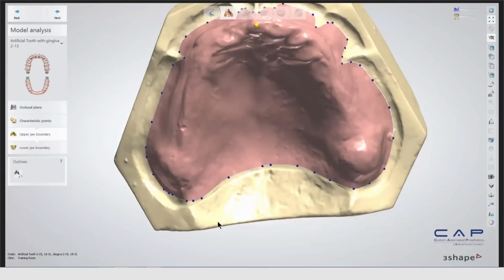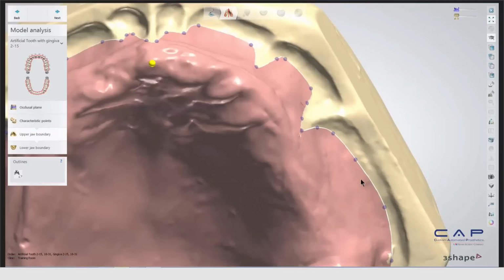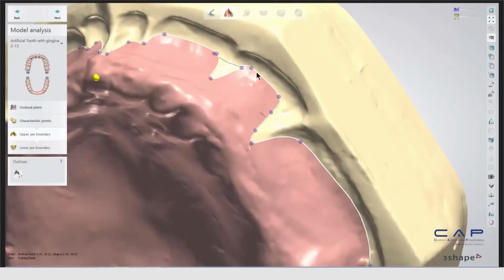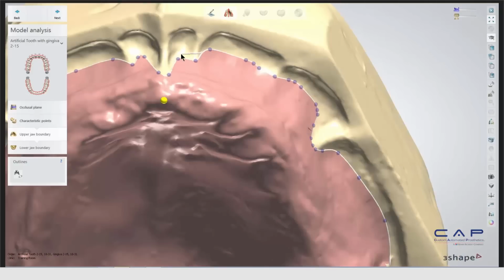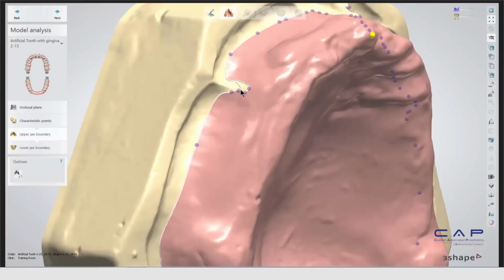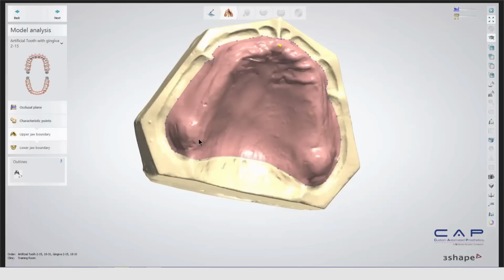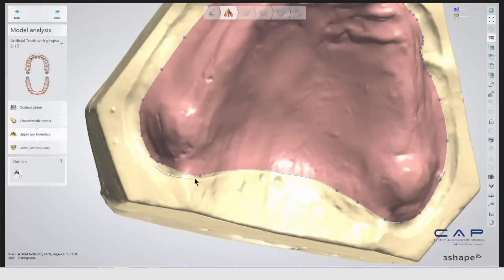Once you do that, you do have all the individual points, and you can pull out all those points to customize that area, or you can just right-click on a point and go to the Fast Edit spline and make the adjustments as you see. So I'm just going to go straight across on that one, and bring this one there. I'm just going to go straight across on this one, and straight across on this one as well. Okay, maybe I'm a little bit too high on this tendon. Just come down there, and come back a little bit over here.